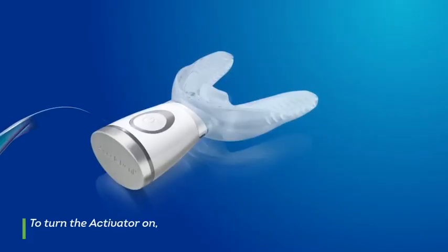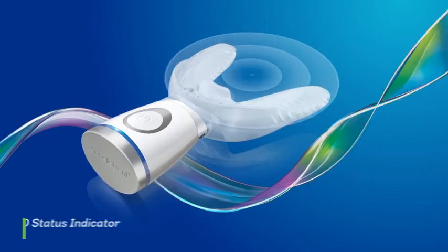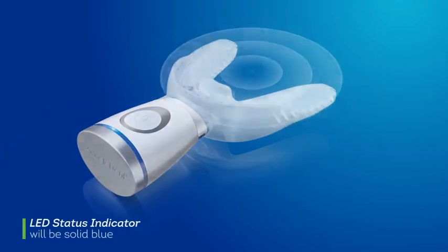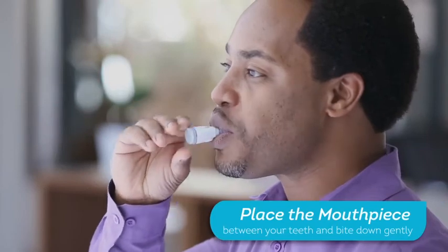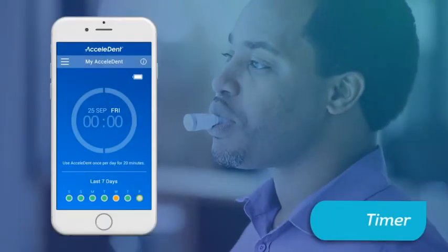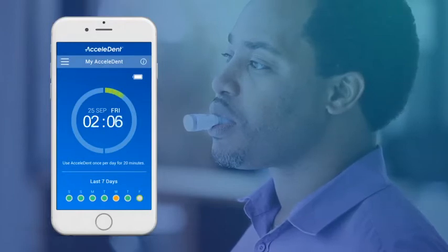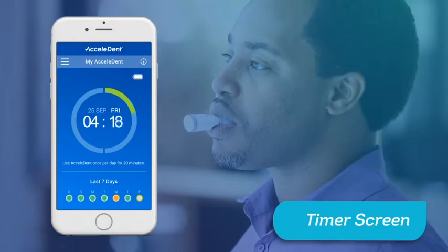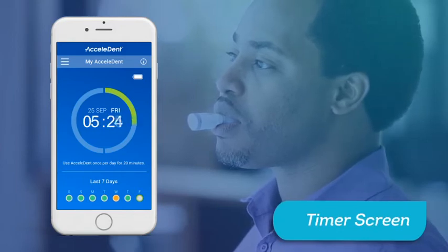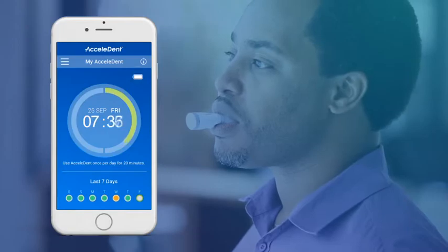To turn the activator on, press the power button. It will vibrate and the LED status indicator will be solid blue. Place the mouthpiece between your teeth and bite down gently. The timer will begin automatically. Once your treatment session begins, your app will automatically start tracking your progress. The timer screen will be your default home screen when you are logged into the app. On this screen, you will be able to see the timer countdown as well as battery status.